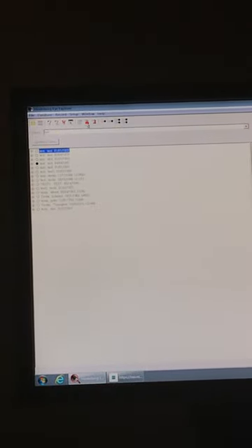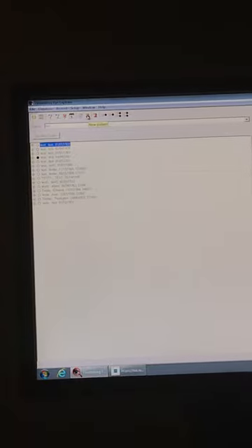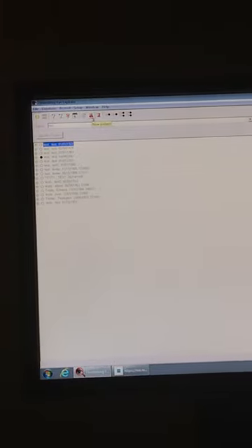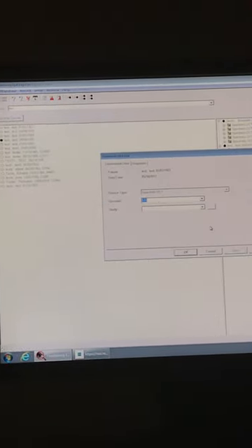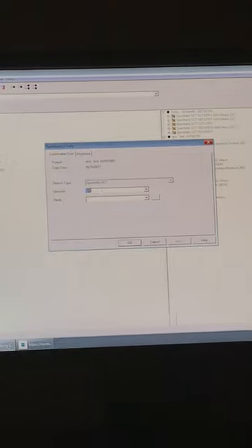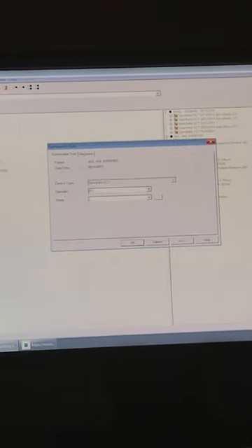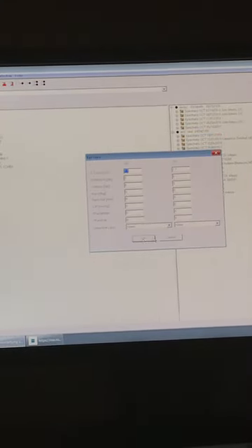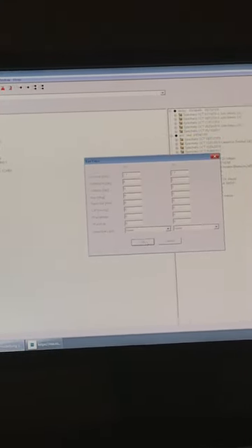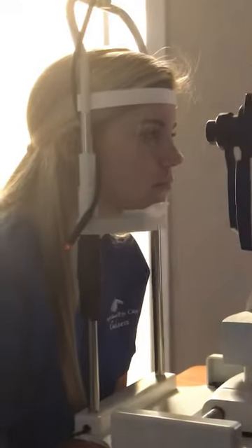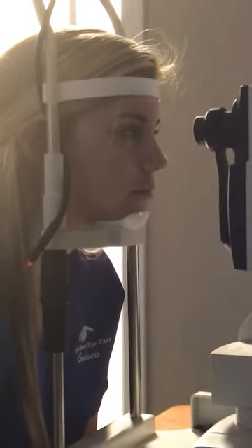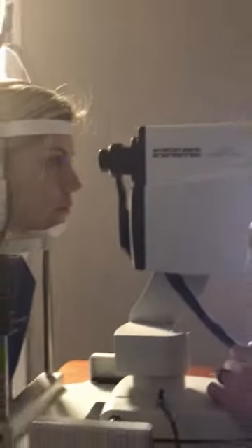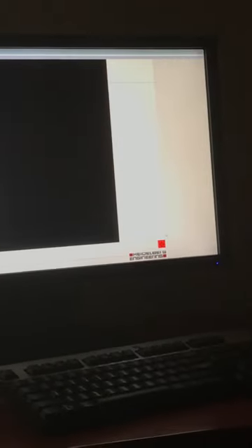Otherwise, you can go to the new patient icon and enter all the information there. The operator is just our initials. Click OK, and OK. Then the patient can come on forward. It calibrates first, and then when this little icon in the bottom turns yellow, we can get started.